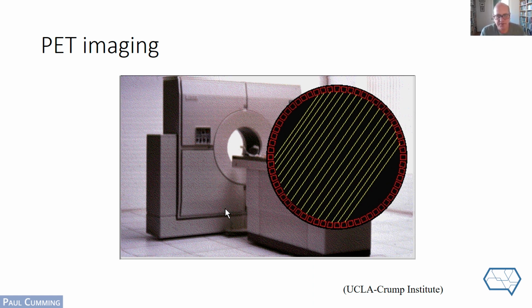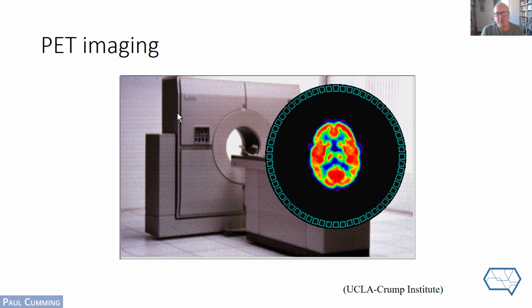Go ahead, next slide. And so by counting millions of those events, millions, literally, and applying some algorithms for reconstructing what the source looked like, that's a matter of medical physics, you can produce an image of the source map of the brain showing where the radioactivity came from and how much there was at any time. Now, I happen to know, or anyone who knows much about PET will look at that and say, it looks like an FDG PET scan, and in fact it is.